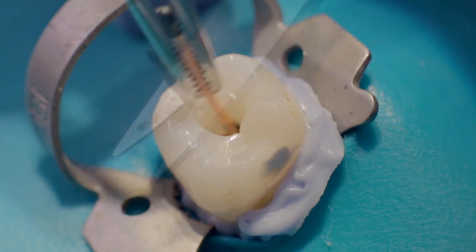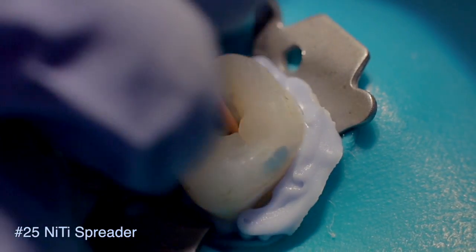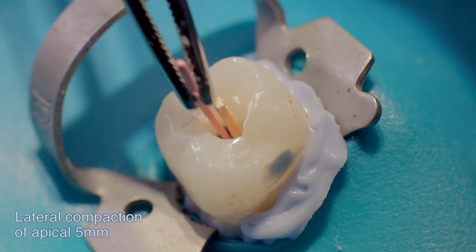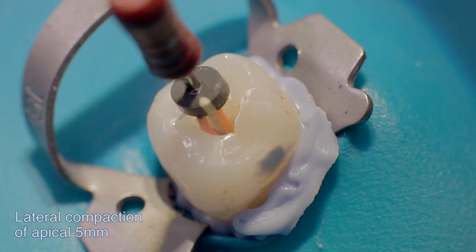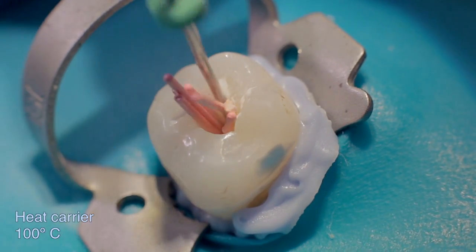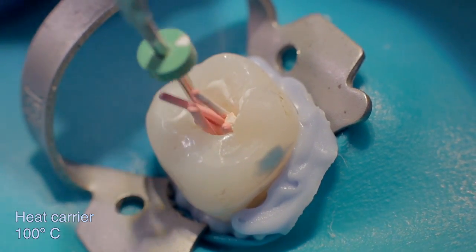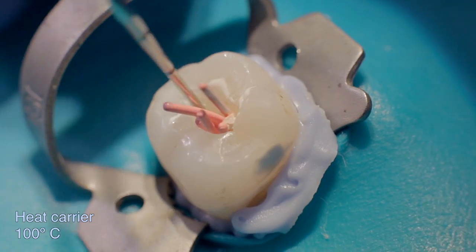The combination technique of obturation, demonstrated here by Dr. Solomanov, combines lateral cold compaction in the apical region with vertical warm condensation in the middle and coronal parts of the canal. This technique allows for better control of the apical region, avoiding excessive sealer extrusion. Information regarding how other common obturation techniques work after SAF preparation can be found in the SAF System Clinical Guidelines Manual.